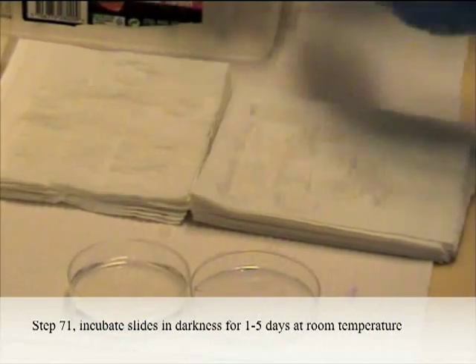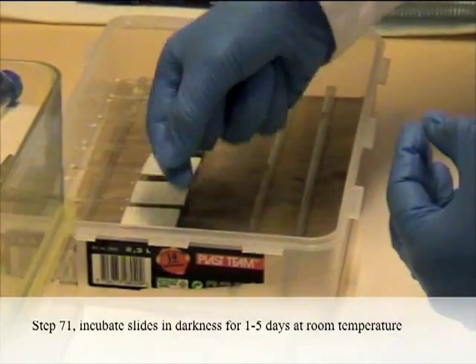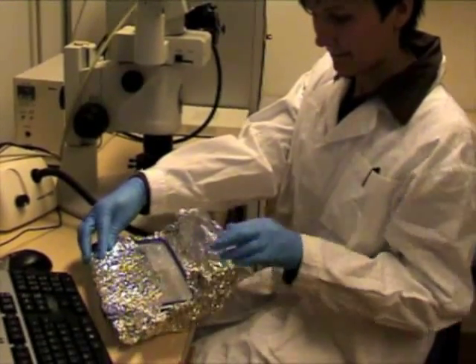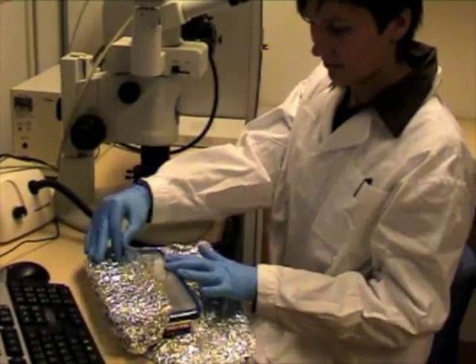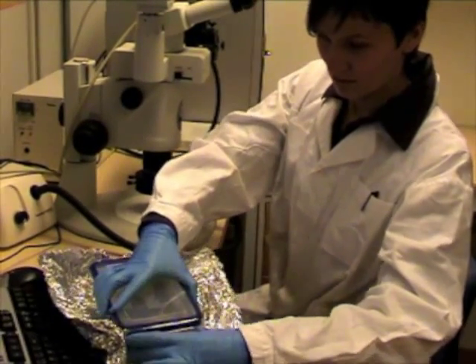Step 71: Incubate slides in darkness for 1-5 days at room temperature. The monitoring of hybridization signals can be done in a stereomicroscope while the slides are still sandwiched. It should be possible to observe purple to brownish stains.